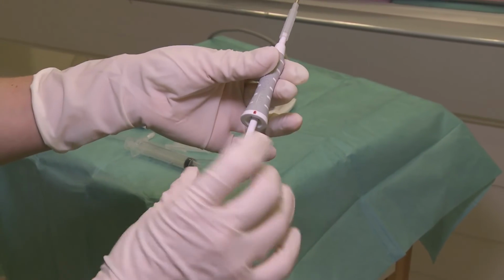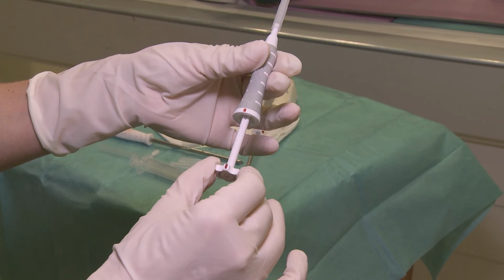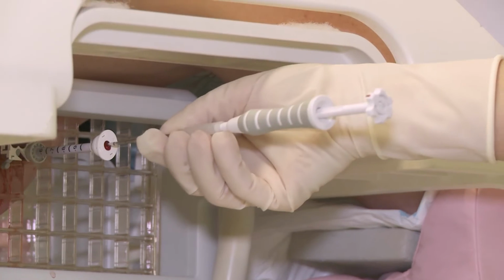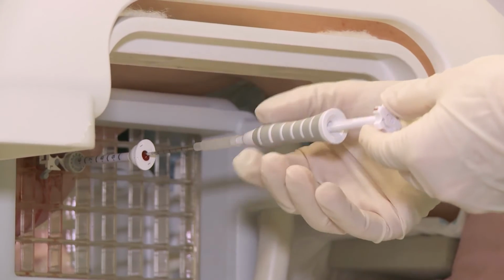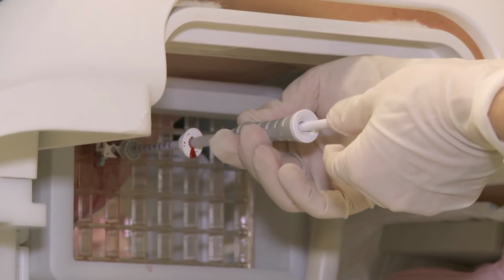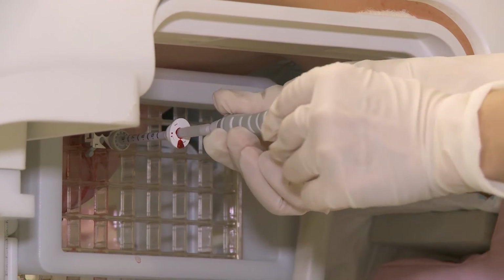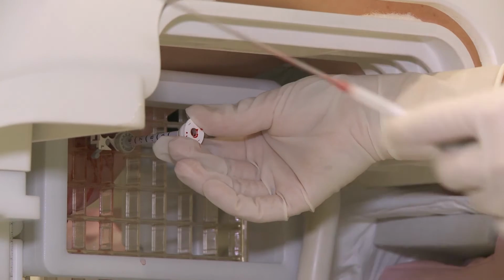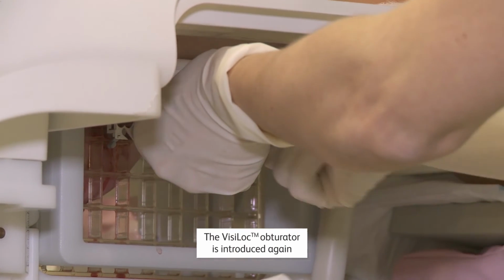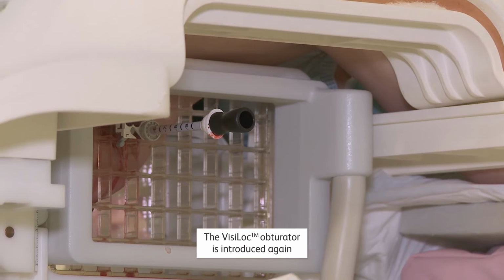The two red indicators in the tissue marker applicator must be aligned for deployment. The tissue marker applicator is introduced through the cannula, making sure the two red indicators are aligned. Push the applicator firmly all the way so that the tissue marker is deployed in the biopsy coordinates. Once deployed, the applicator is rotated to make sure removal of the applicator does not displace the tissue marker.